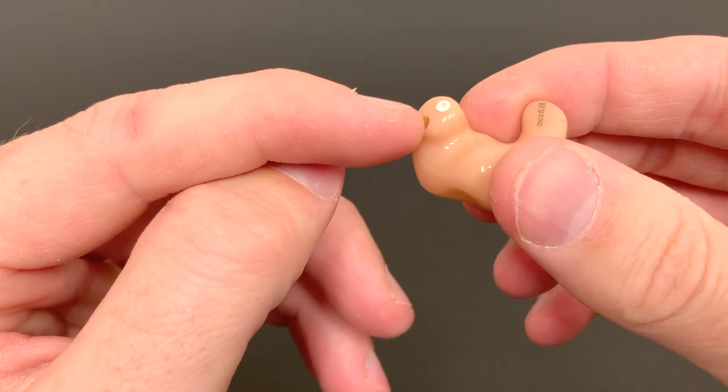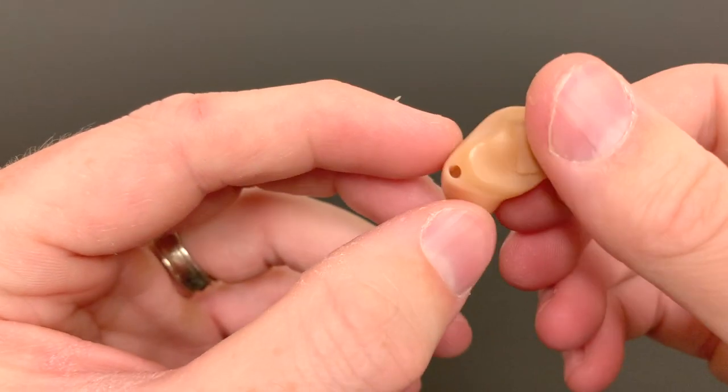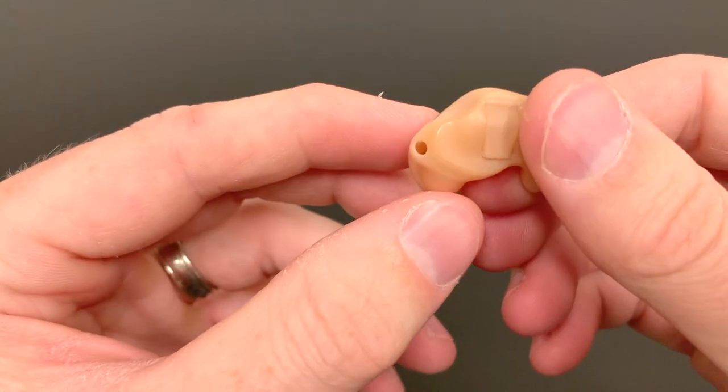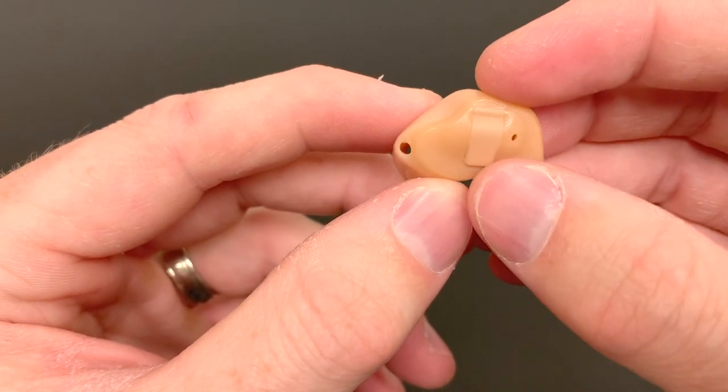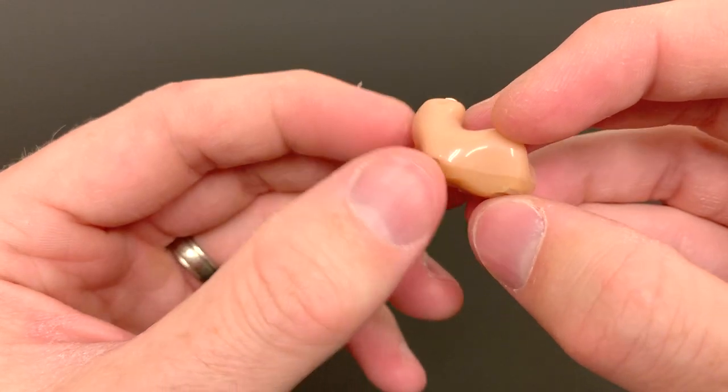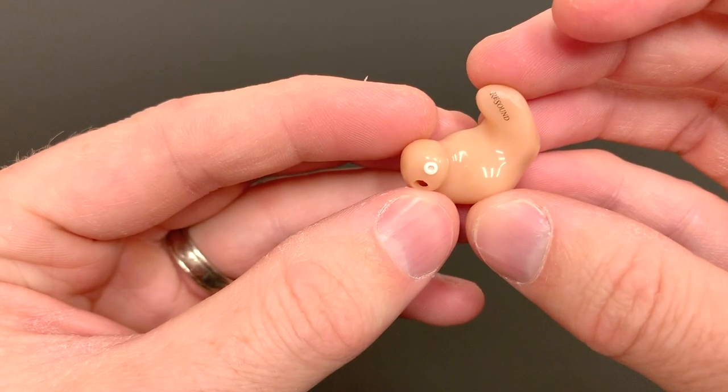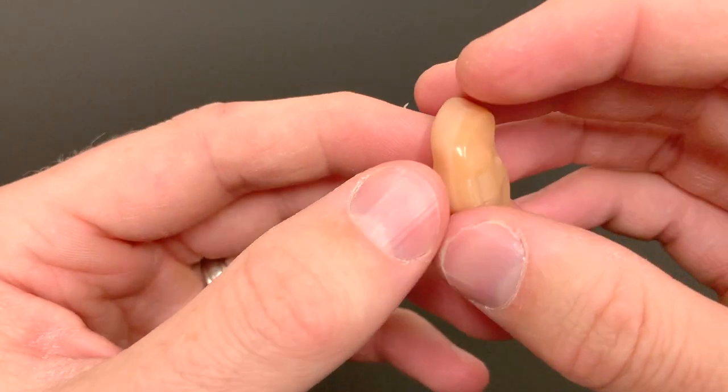Some of these styles of hearing aids have an additional hole here, and what that is called is a vent. We use that vent to help with comfort with the hearing aid, but also to change the acoustic or sound response of the hearing aid.